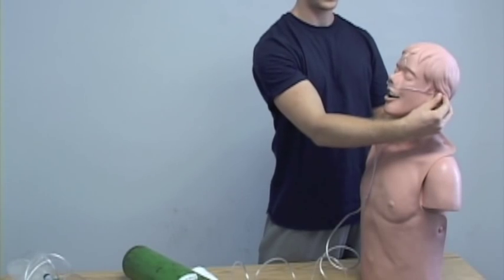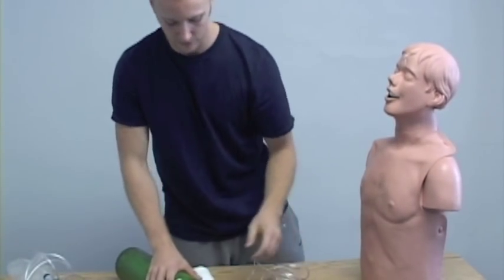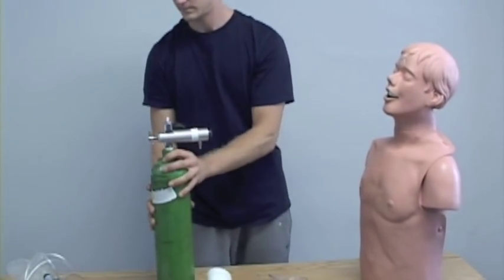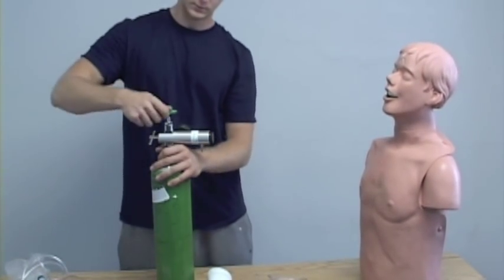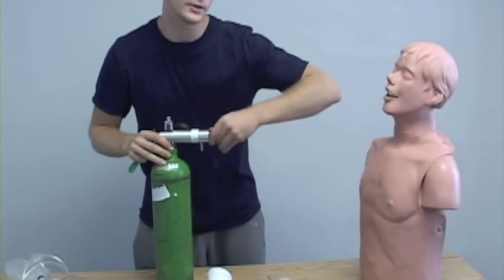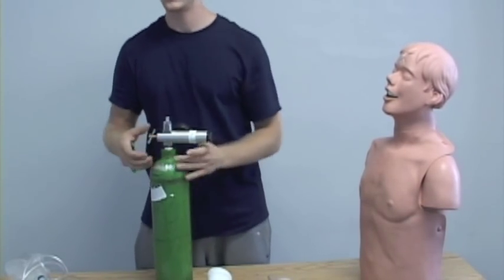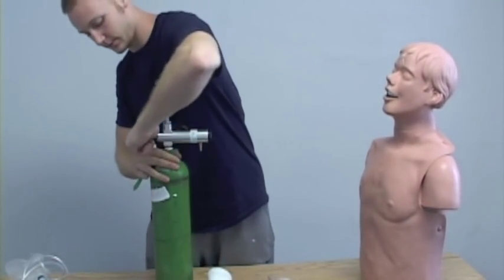Discontinue oxygen therapy. Take the nasal cannula out. Turn it off. Unplug it. Close the tank off. Allow out any air that's left in the line, and then screw this.